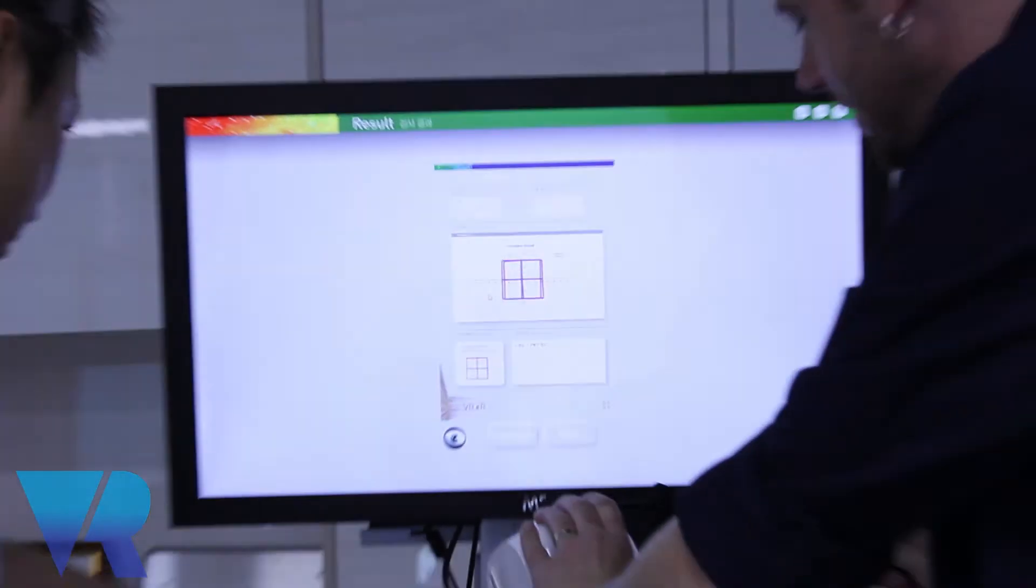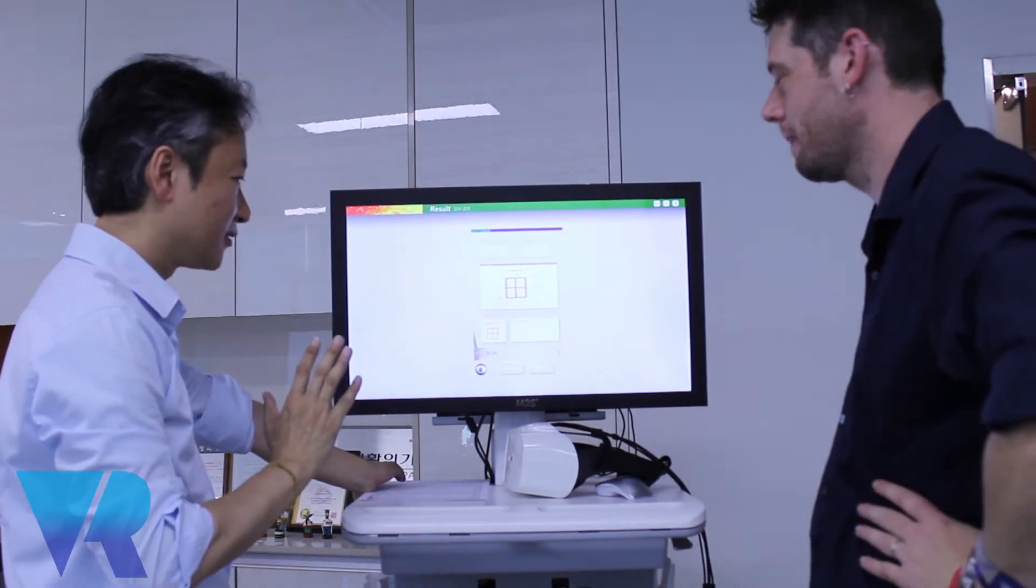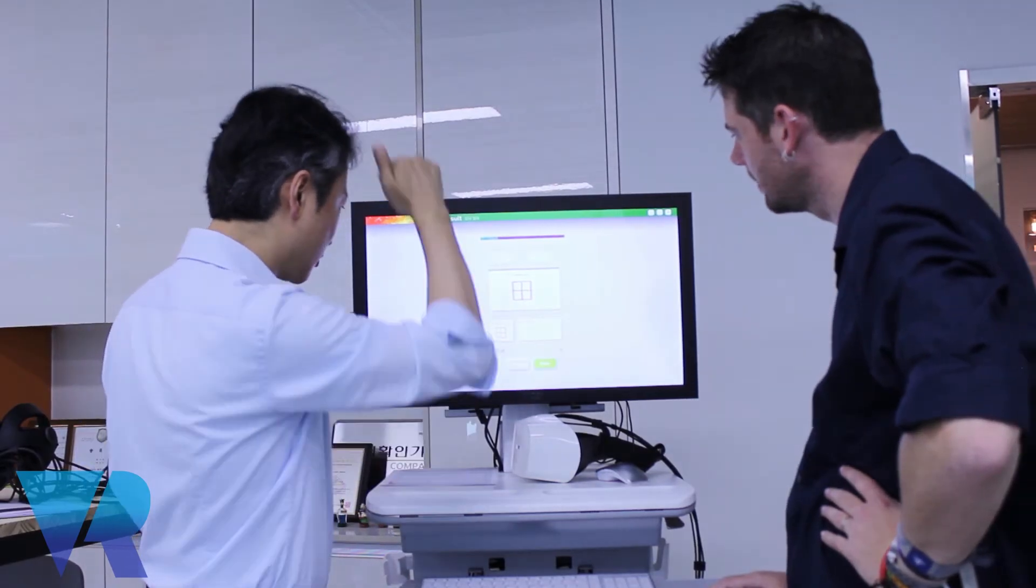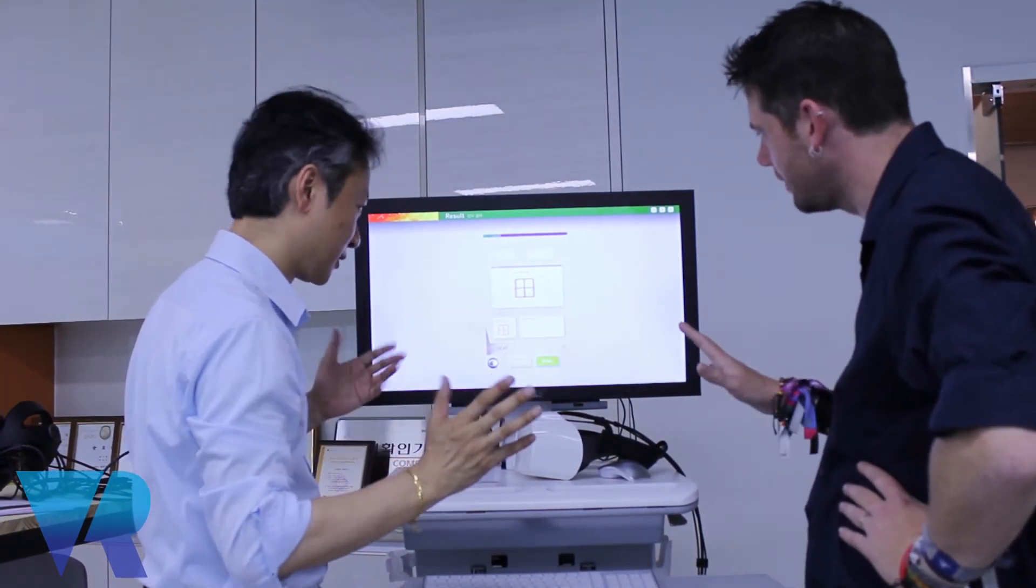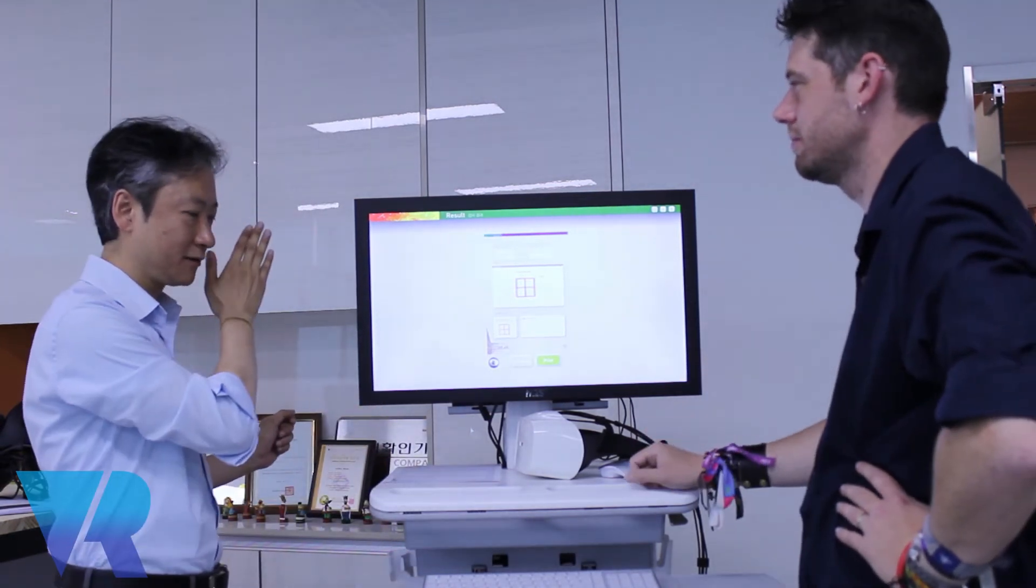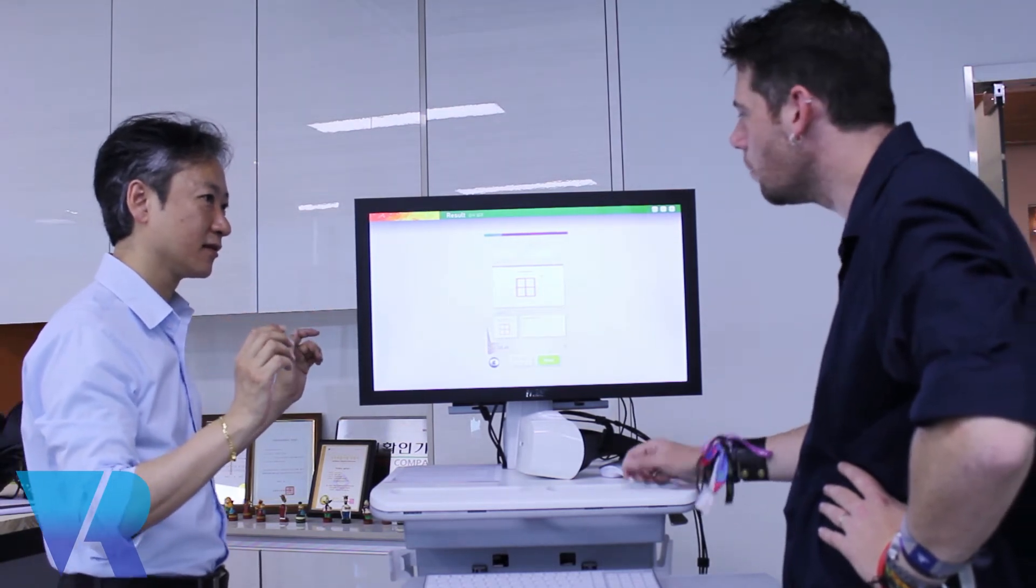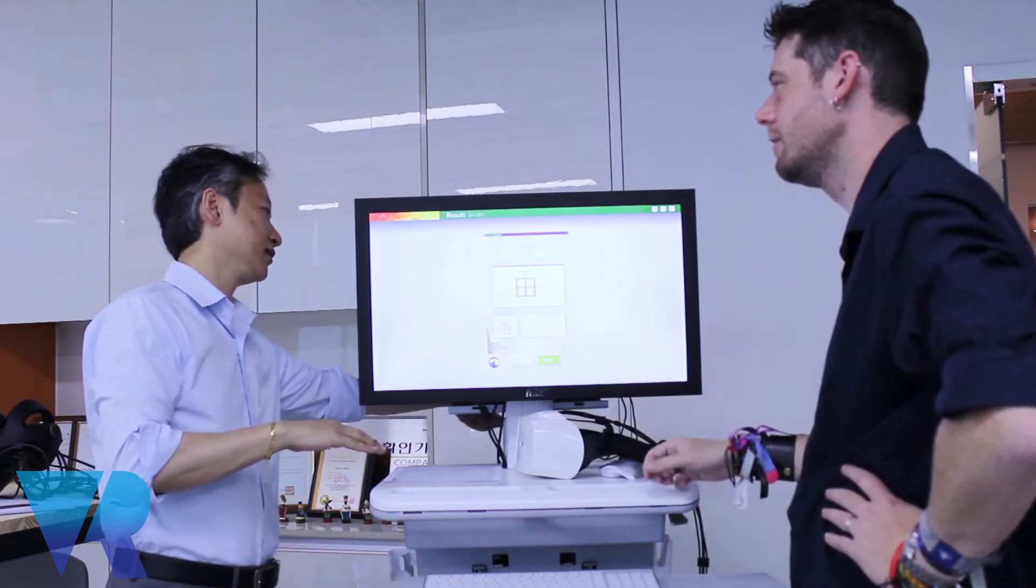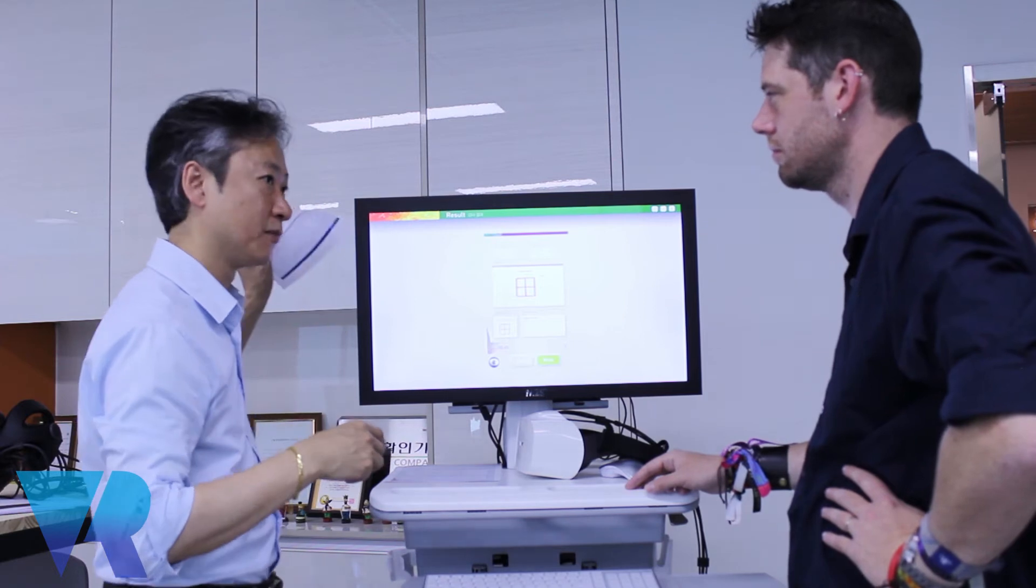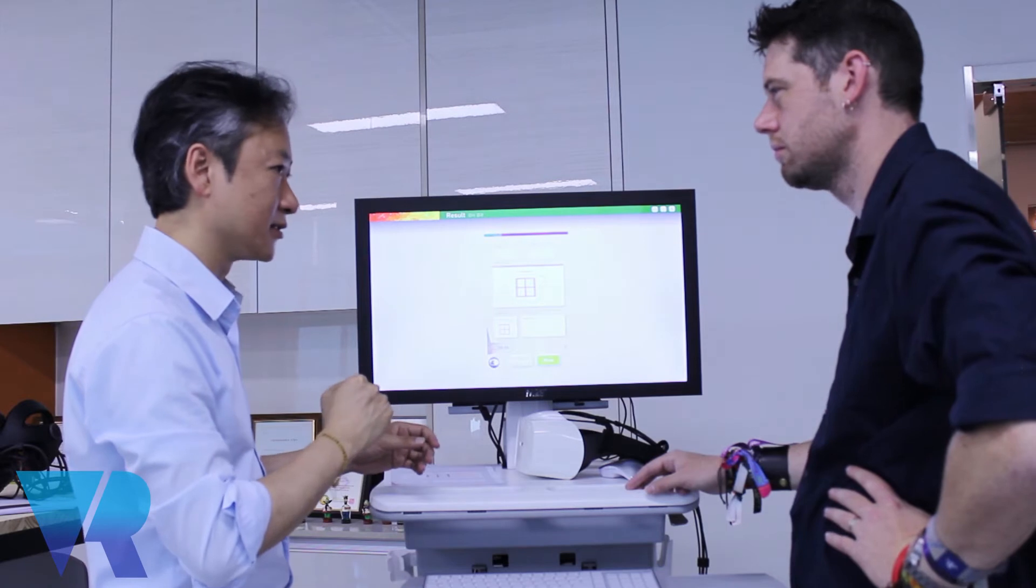With your left eye, you got a little bit off. If you see the center or top, bottom, that's pretty good. But when you take a look at left side or right side, it's a little off. Do you know why that might be? Is it not because of the muscles? We've already done that test. There are several reasons. It could be muscle, could be just your eye condition.